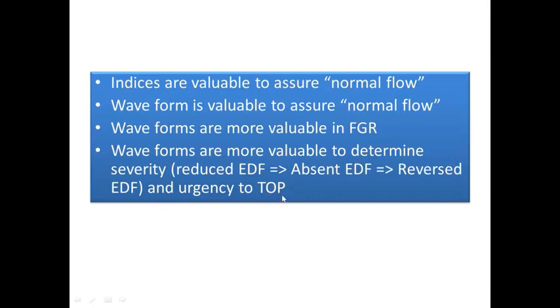Of course, the termination of pregnancy is a decision dependent on the waveforms and the patient. It's not a paper interpretation, it's a patient treatment. So you have to consider the obstetric history, the gestational age, the waveforms that are present, and other factors. But generally speaking, if there is reversed end diastolic flow, there is a need for expeditious delivery.